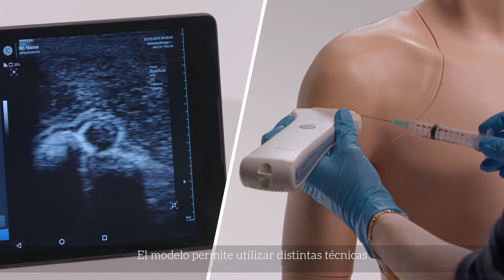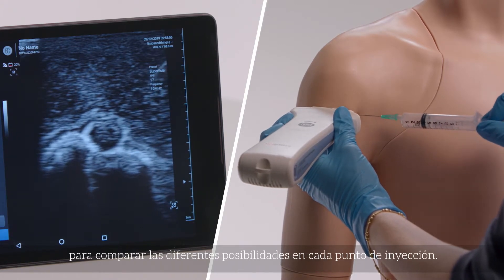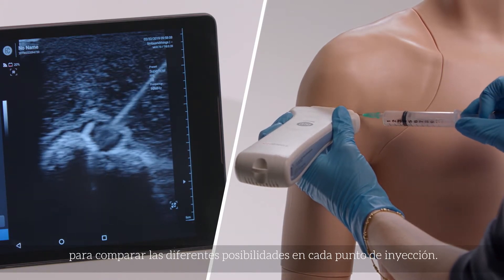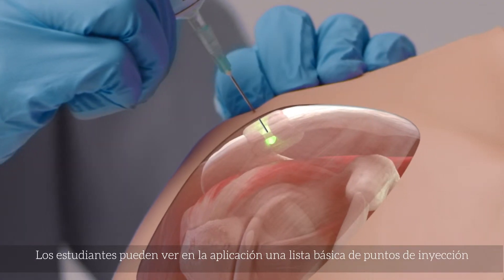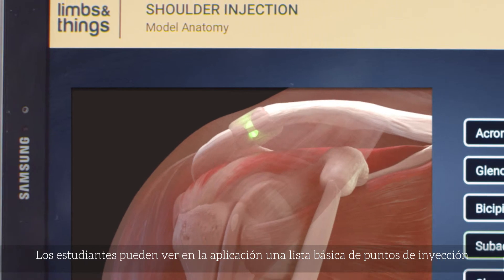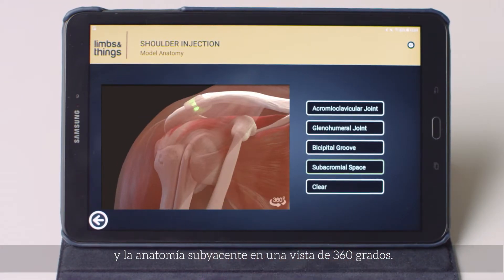Accommodating different techniques, the model allows for the comparison of the varying approaches to each injection site. Within the app, trainees can view a simple list of injection sites or the underlying anatomy in a 360-degree rotatable view.